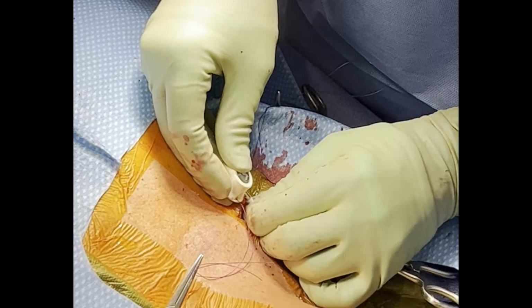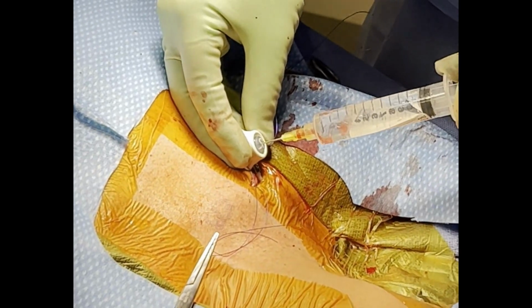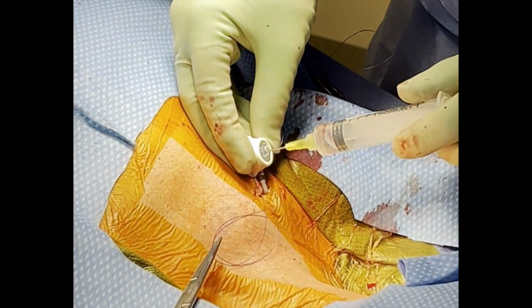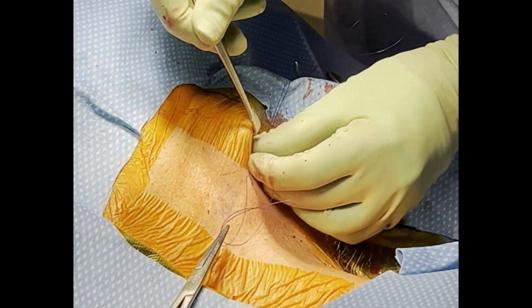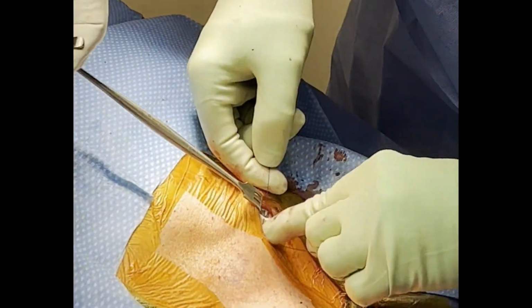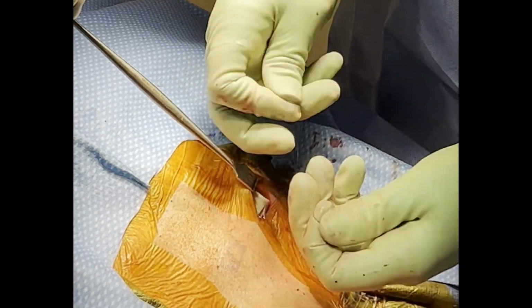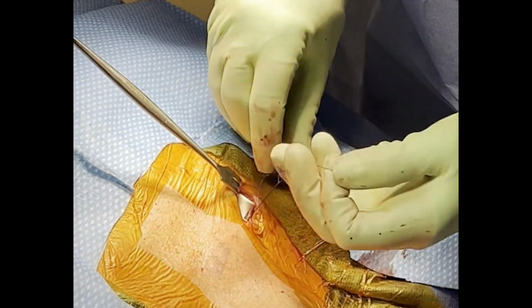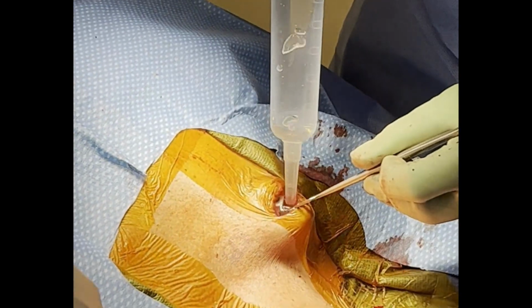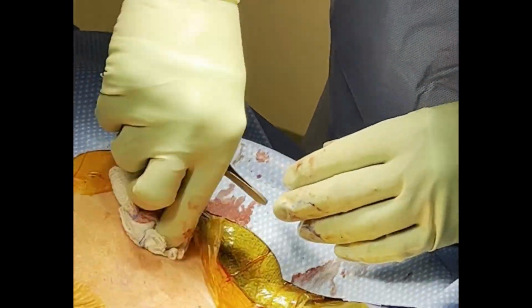Carefully attach the catheter to the port, leaving as little slack as possible and trimming as necessary. Then test the port and flush it using a mixture of saline and heparin. Now, insert the port and secure it by tying the sutures. Finally, irrigate, confirm hemostasis, and close the skin in 2 layers.